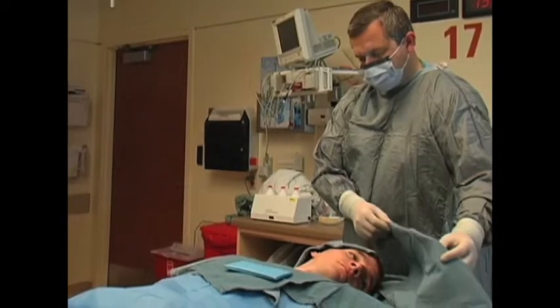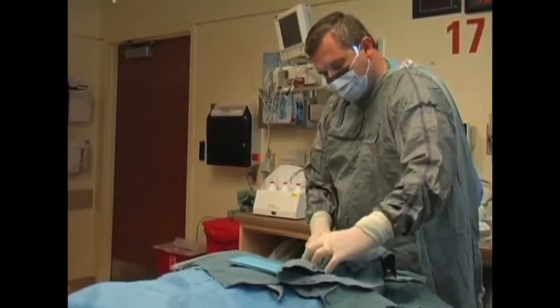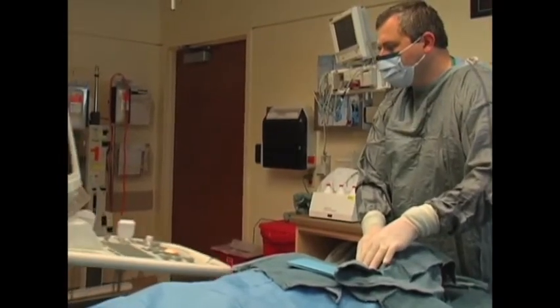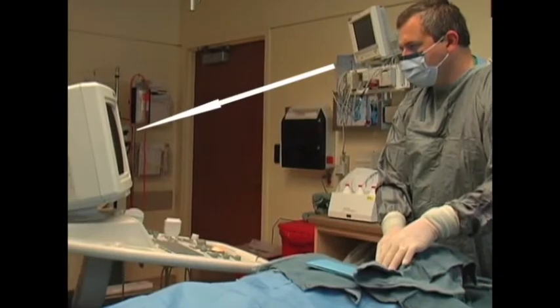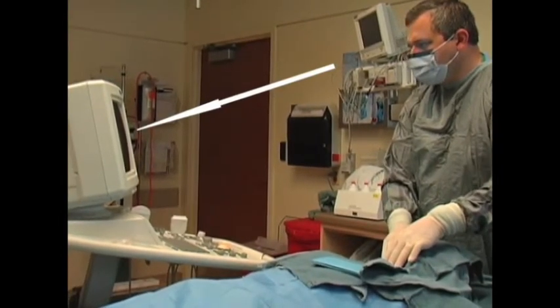We'll demonstrate the middle approach first, using the right internal jugular vein. Dan is having the machine positioned so that it's at the patient's right side, and the screen is in his direct line of sight, so he does not have to turn his head while he's performing the procedure.